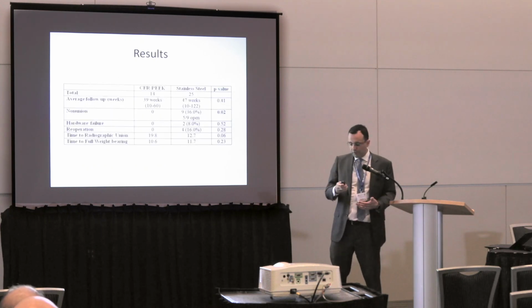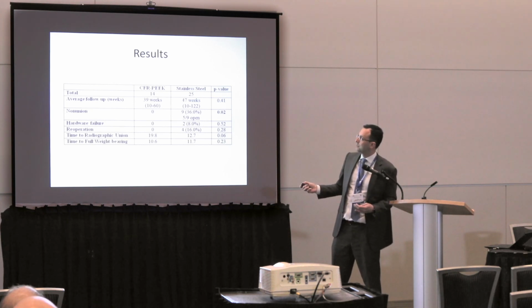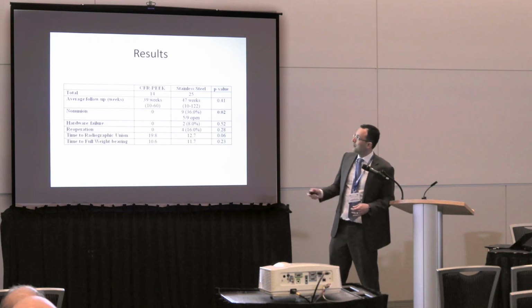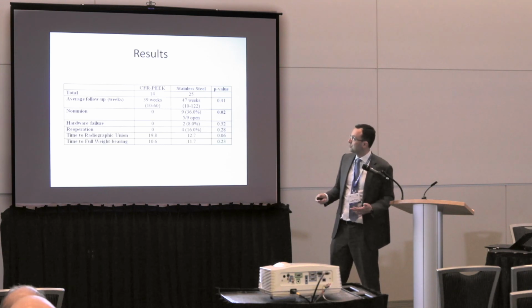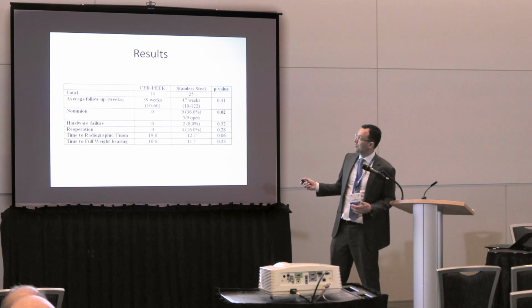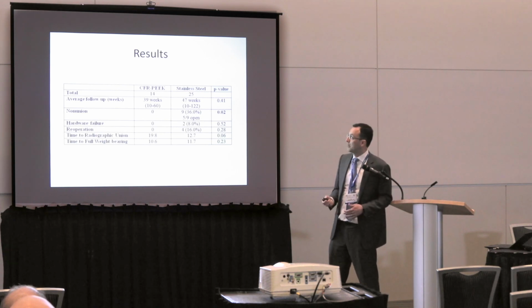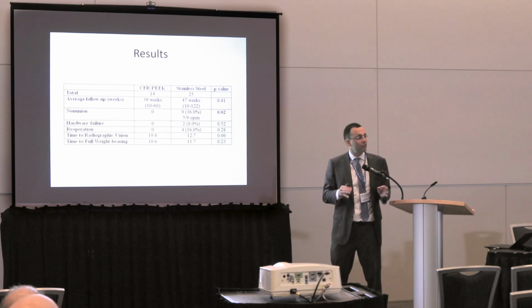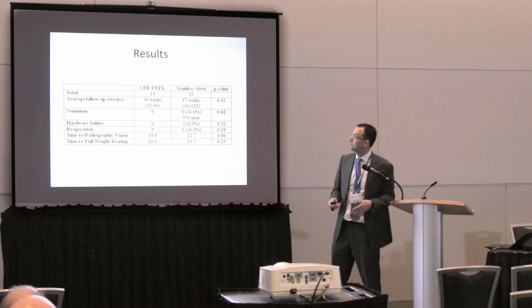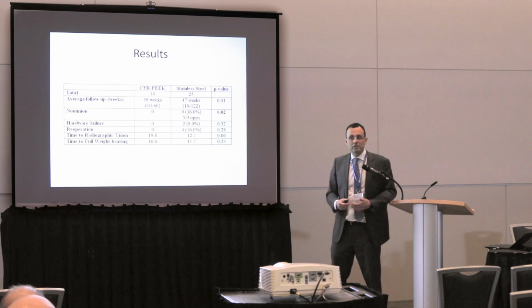What I was really proud of is our follow-up on these patients: an average of 39 weeks for my carbon fiber patients and 47 weeks for my stainless steel. If you look, these people were walking maybe a little faster. There was no hardware failure and no non-unions. In the stainless group, this was statistically significant, with a 36% non-union rate. Five out of the 9 were open fractures, but if you remember what I mentioned earlier, the CarboFix group had the same amount of open fractures and fracture types when I compared the 2 cohorts. So this was very convincing to me that this stuff works.